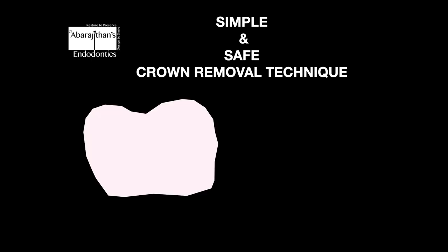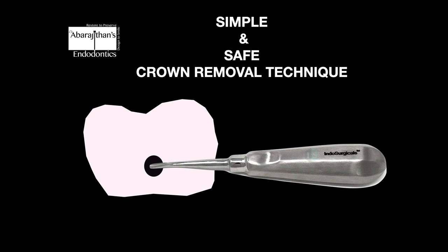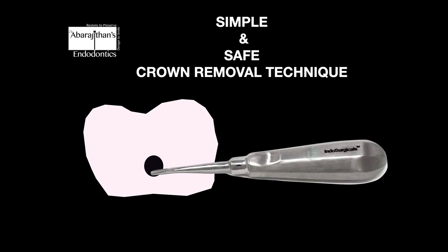This is how the simplified technique goes: when you have a crown, we make a small keyhole on the buccal side, following which we use a simplified instrument like a coupland elevator and place it in the hole, giving some gentle clockwise and anti-clockwise rotation.